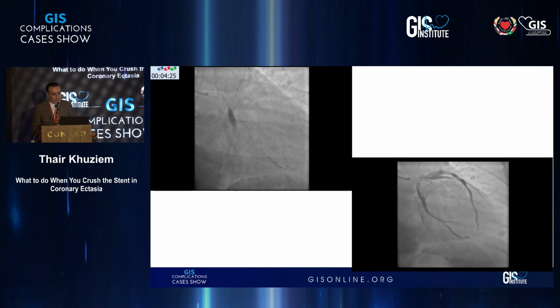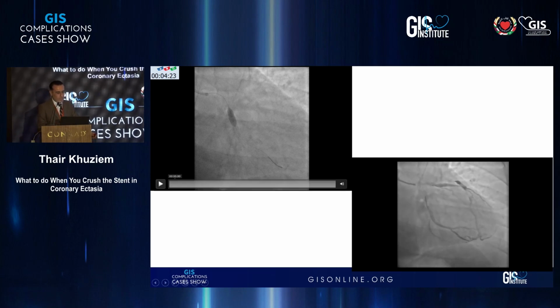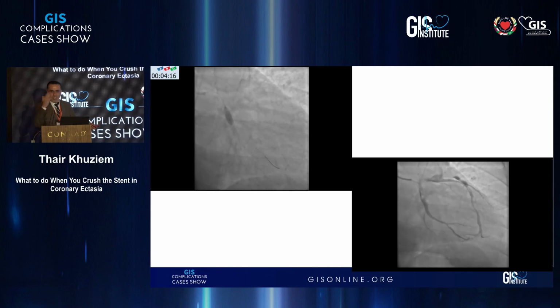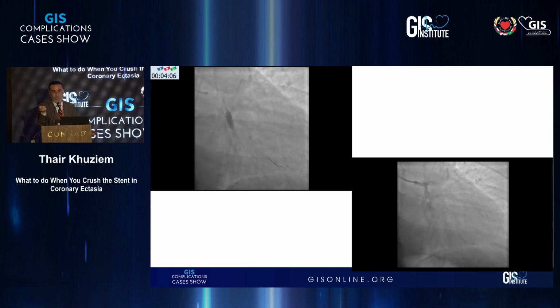And if you look to this image, the balloon is inflated, but part of the stent seems away from the balloon. So that's confirmed that actually we went first of all with a small balloon, because we found even the large balloon difficult to pass the proximal stent. So we passed with a small balloon to create a space, and till this point we don't know that we are behind the stent, then we get inside the stent.